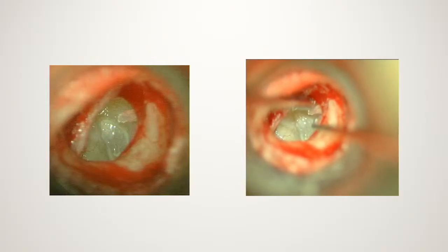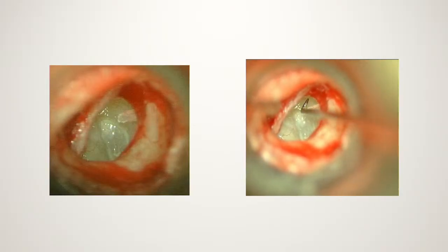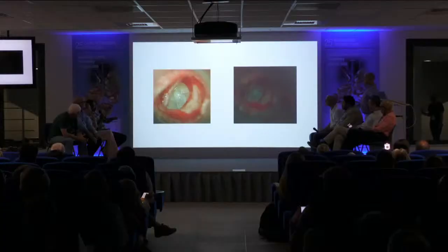We've decided on surgery. We've been dispensed with hearing aids. We're in there. That's what we've got. It's a ventilated ear with a slightly eroded incus. Yeah, no superstructure. But the foot plate is mobile. The foot plate's definitely mobile, yeah.